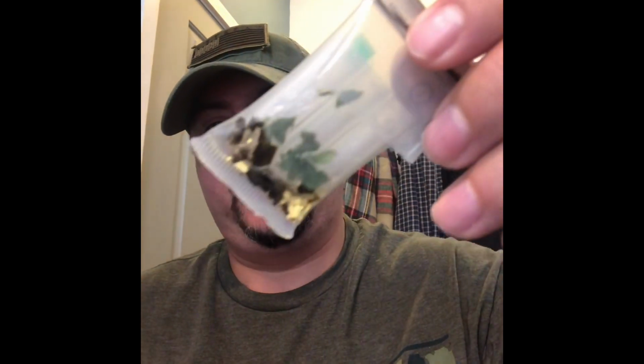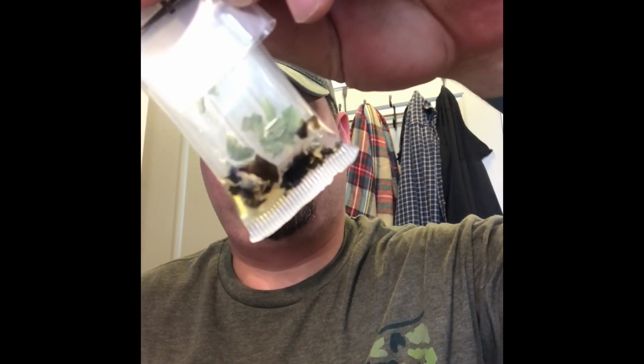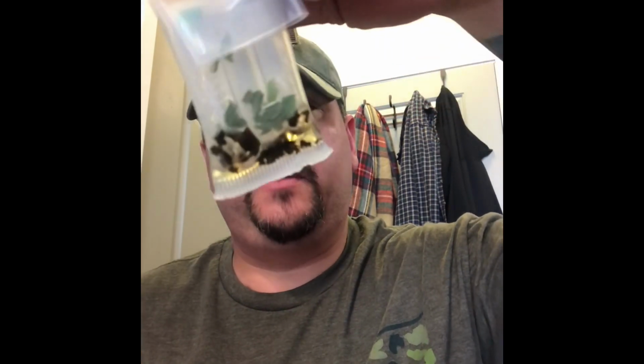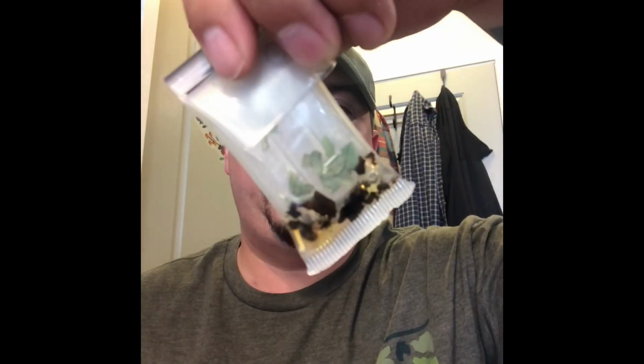In the video, like I said, these scientists tested empty kits, and they said, oh, this is so alarming because it changes colors and you get a false positive with nothing in there. But why would we test air or nothing? It wouldn't happen. So this is nothing still. It's supposed to turn green, probably because of the oregano, but it's just got that tint of dirtiness in there. So using any sort of discretion, that would not be a positive for me.